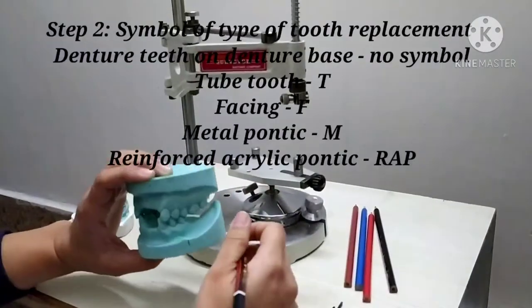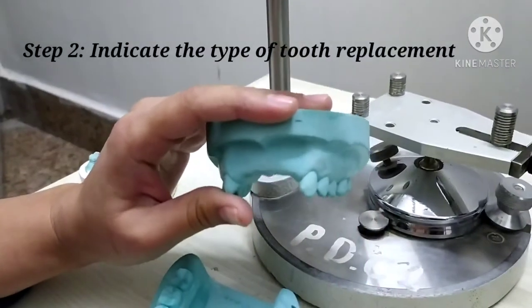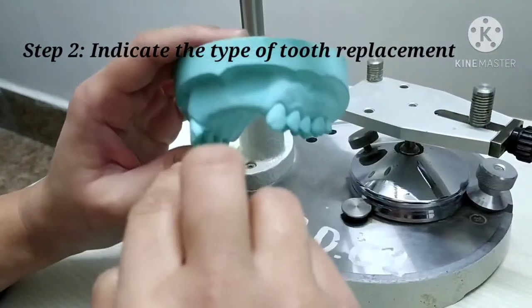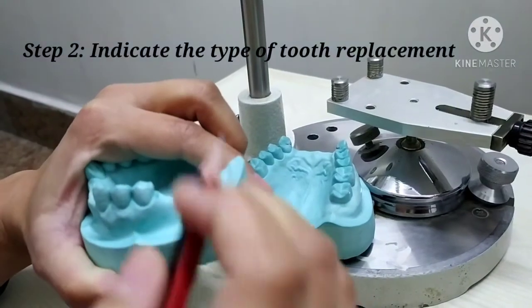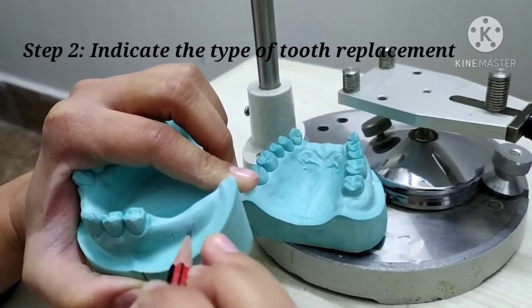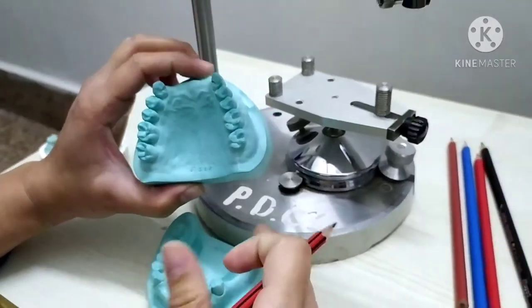The second step is indicating the type of tooth replacement desired with the help of a pencil. If you are going to replace any missing tooth with tube teeth, facing, metal pontic, or reinforced acrylic pontic, then the symbol has to be marked onto the tissue surface of that particular area. For each tooth to be replaced, the marking is done on the soft tissue surface underneath. If going to use denture teeth for a denture base, then no symbol is indicated.